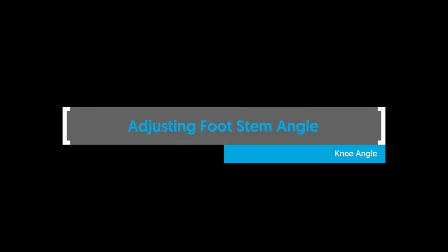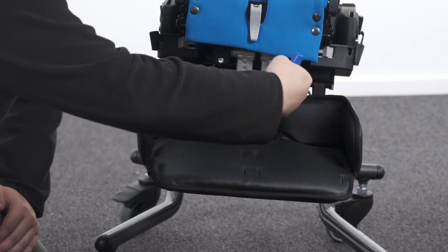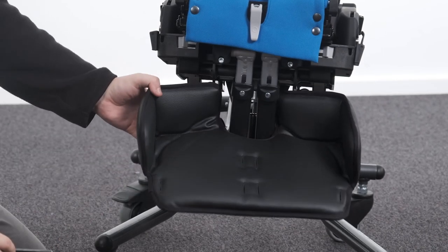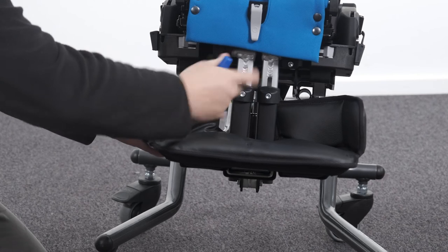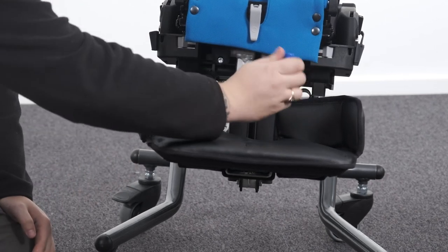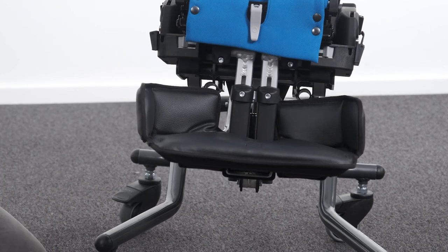Adjusting foot stem angle — knee angle. To adjust the footstem angle, loosen the bolt and rotate the footstem to the desired position. Tighten the bolt to secure in position. For the two-piece footrests, the angle can be adjusted independently. For the one-piece footrests, the bolts need to loosen simultaneously to allow for adjustment.